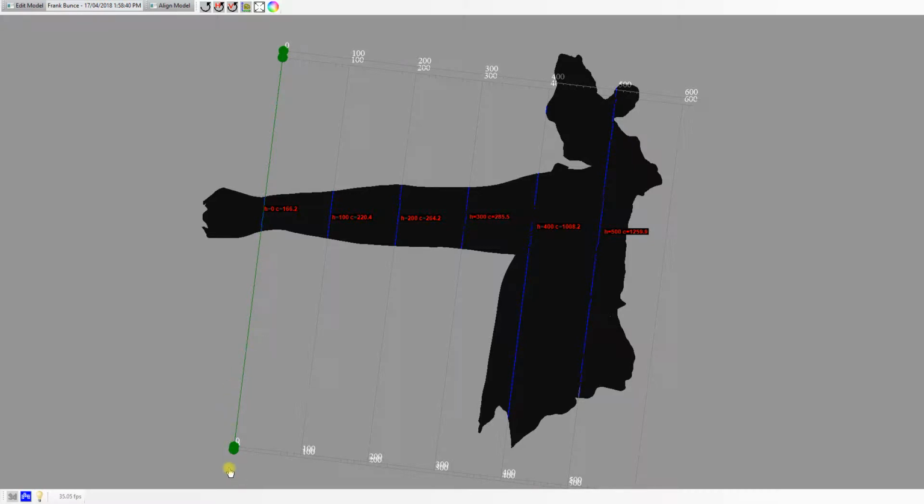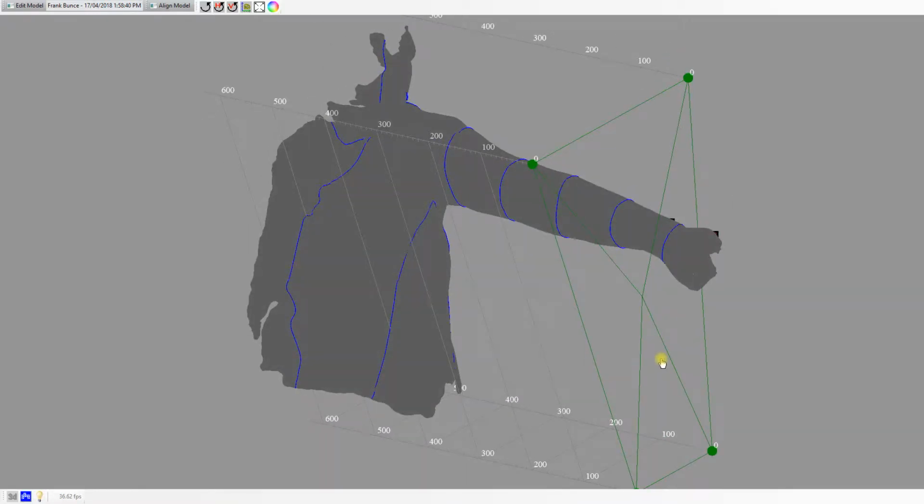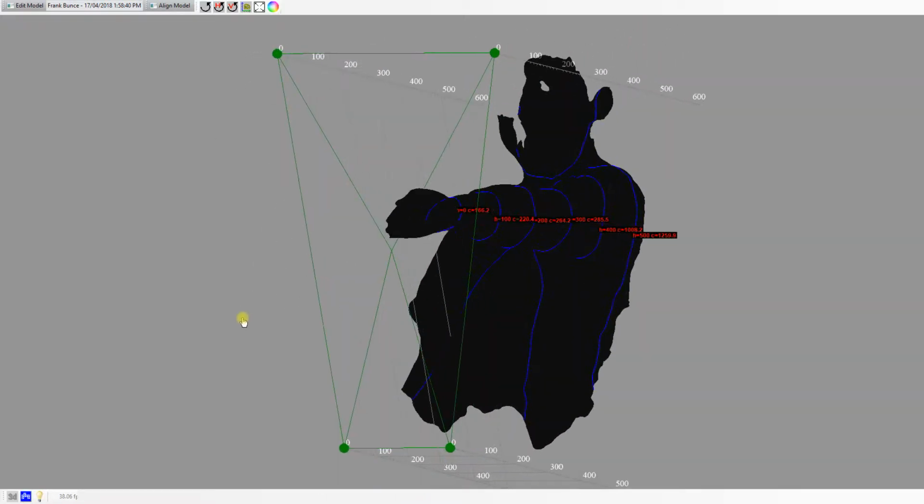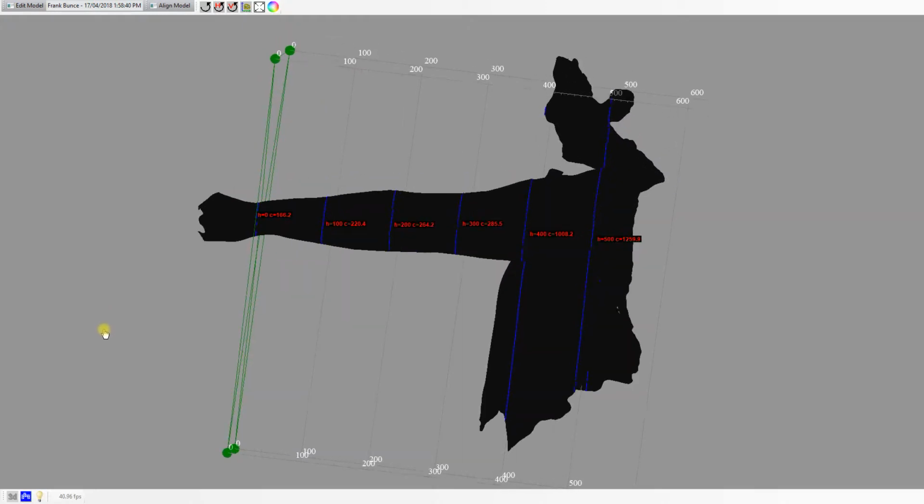Now, the reference plane can be set by the end user to be just about anywhere on the image, but in this case it's doing exactly what we want it to do. It's giving us a very clear banding along the patient's arm and even up onto their nose and body that shows us the numbers that we want.